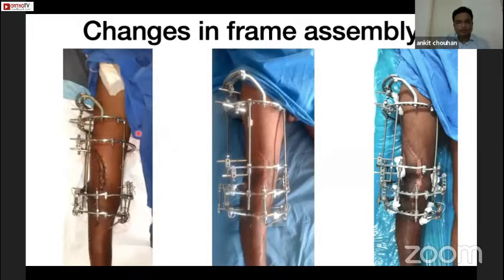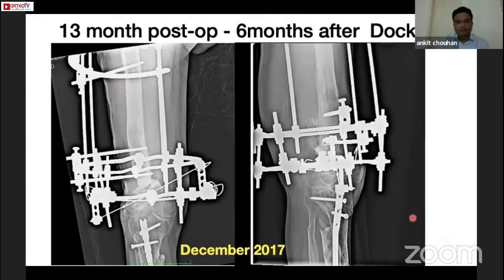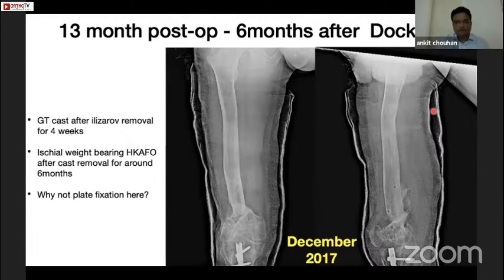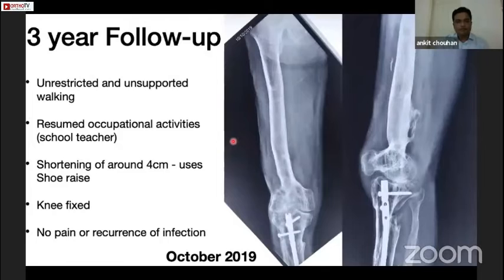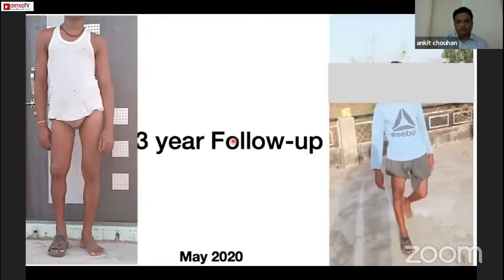This is how the frame changed over time — just after surgery, after completion of bone transport, and at the time of docking and bone grafting. In the lateral view, some amount of flexion was given to correct alignment. At 13 months post-op a healed fracture was shown, the frame was removed and a cast was given for four weeks, after which the patient used HKAFO for six months. Plate fixation was not done here due to the long history of infection around the distal femur site and fibrotic scar on the lateral aspect. Three years after Ilizarov removal, the bone and regenerate had consolidated well with shortening of around four centimeters requiring a shoe raise. The patient was able to resume previous occupational activities.